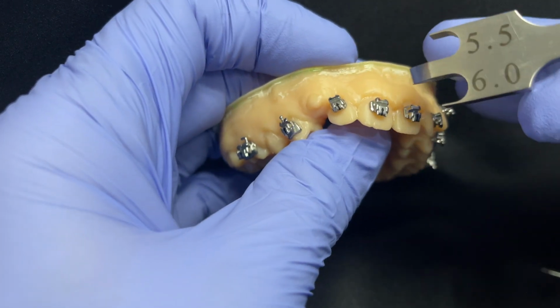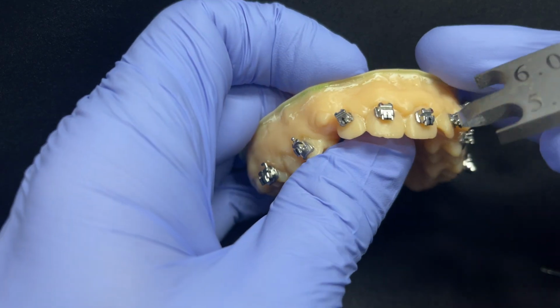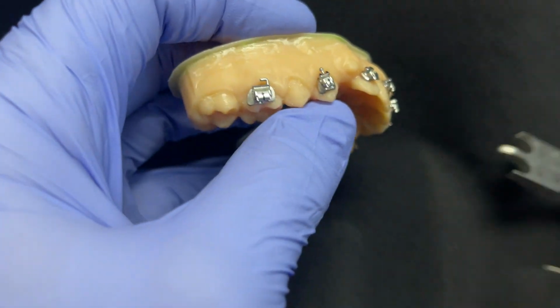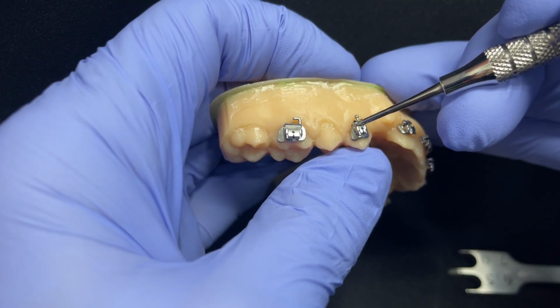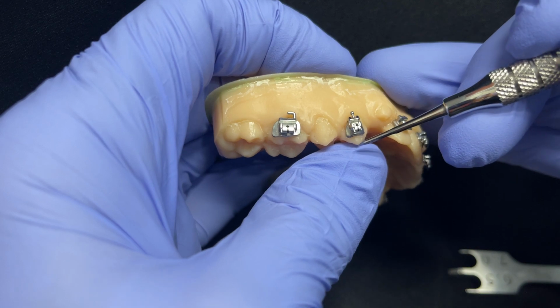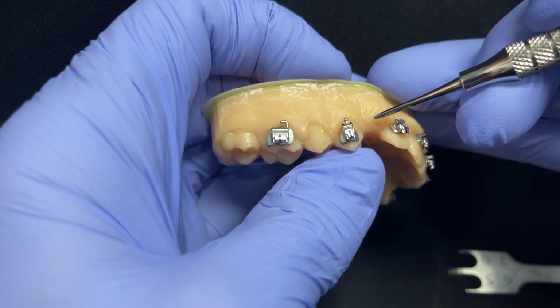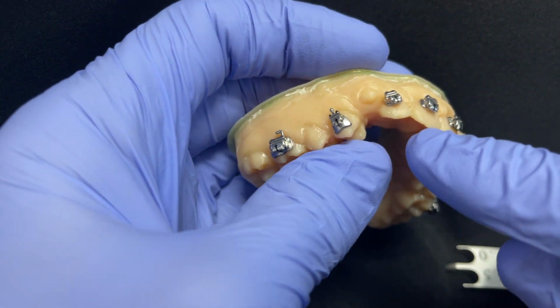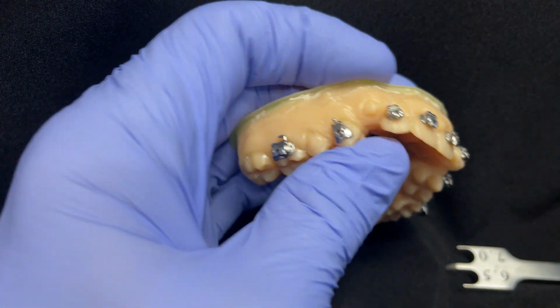All right, and then that means that the central incisor needs to be up here at 6. Now, if we don't want to put our brackets up that high, it's pretty simple. All you got to do is come back over here and move this premolar down 0.5 millimeter, because it's all relative. So if we move this down just 0.5 millimeter, now we've got this premolar set at 4. That means that the cuspid will be at 4.5, that the lateral will be at 4.5, and the central should be at 5.5. Actually, central should be at 5.